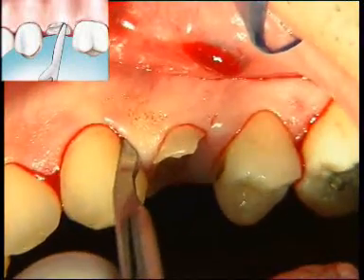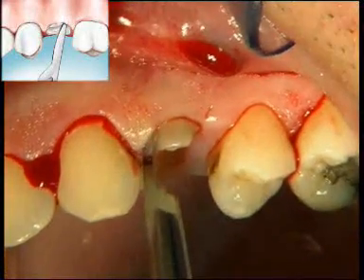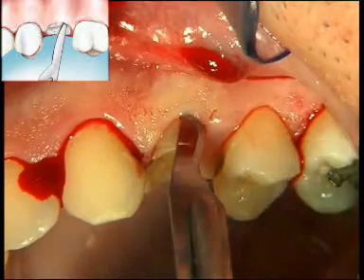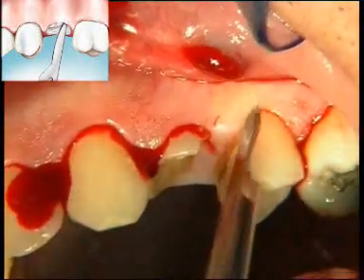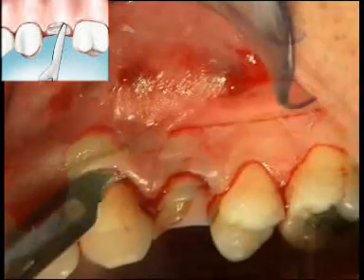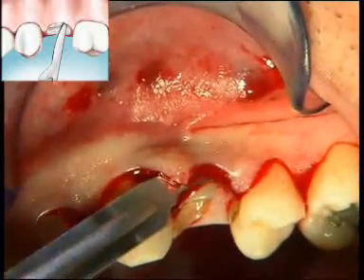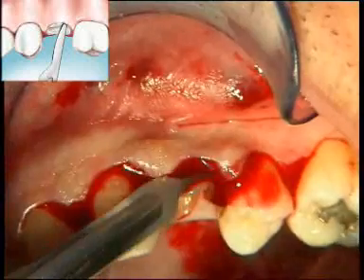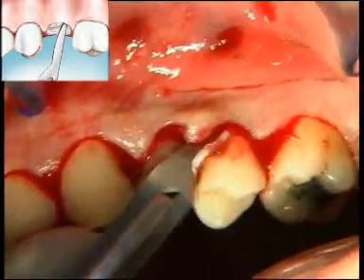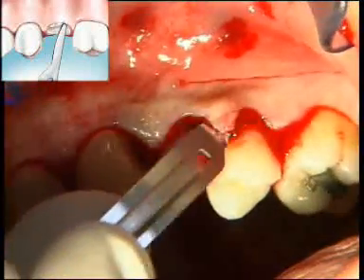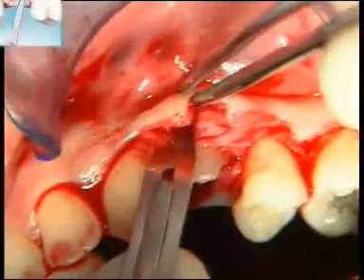After local anaesthetic, an intrasulcular incision is made with the aim of preserving the quantity of keratinised tissue present, extending into the sulcus of the two neighbouring teeth — respectively the canine and first molar — thinning the respective mesial and distal papillae. A partial thickness flap is carried out until the mucogingival junction is reached and then going beyond it by a few millimetres, thus acquiring extreme mobility which will allow an adequate and desired apical positioning.